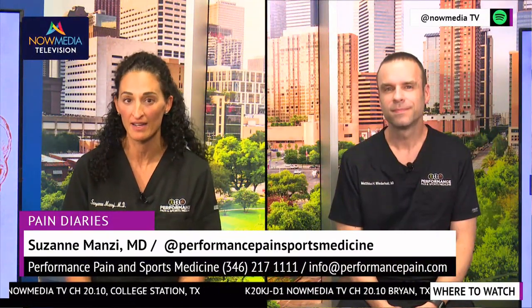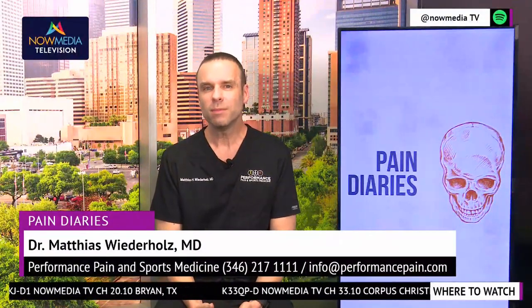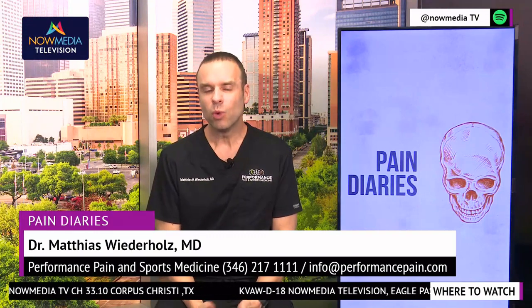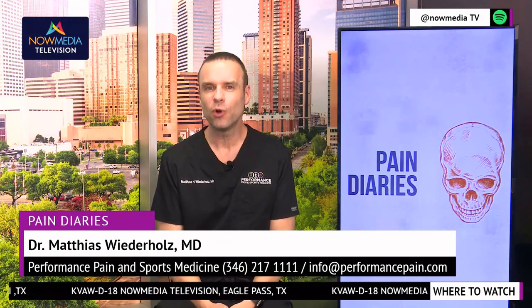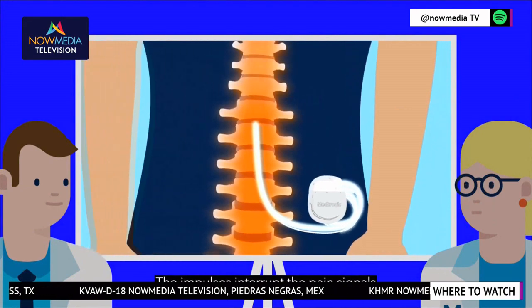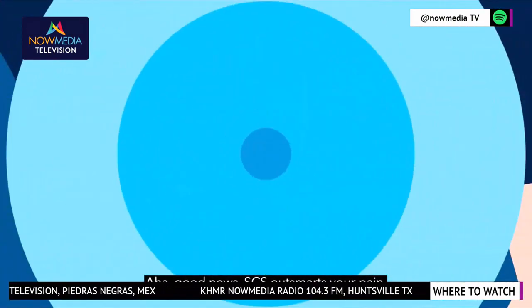So let's go over some of the specific conditions or criteria that need to be met for a patient to even get a spinal cord stimulator. Of course. So spinal cord stimulation, again, chronic pain. What type of pain are we talking about? We're talking mainly nerve pain, which is burning, tingling, shooting, those types of pain conditions. Who develops nerve pain? Well, people that have had back or neck surgery that have persistent pain tend to have this type of nerve pain. Additionally, there are various conditions called complex regional pain syndromes where people develop nerve pain either from prior surgery or frankly sometimes it just develops. And that is often a very debilitating type of nerve pain.